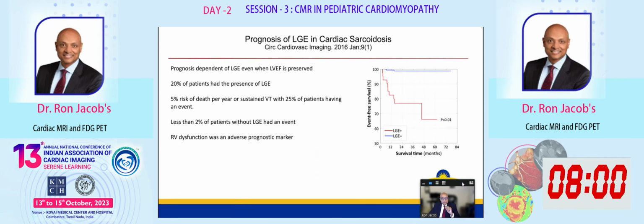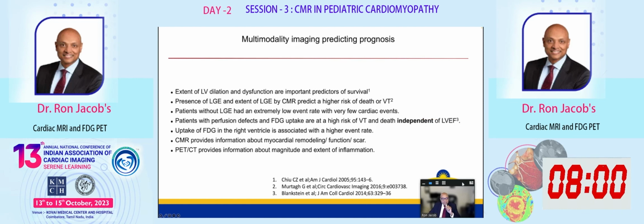This is another paper that was published in 2016, essentially saying the same thing, that 20% of patients had LGE. If you look at these curves, if you didn't have LGE, you did reasonably well, with a very low chance of events. If you had LGE, you had a reasonably high chance of events.